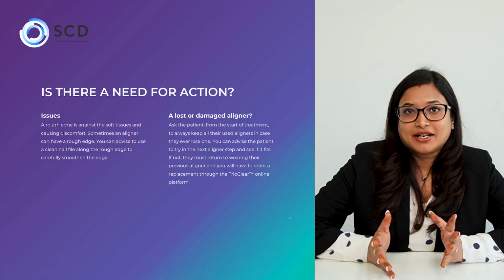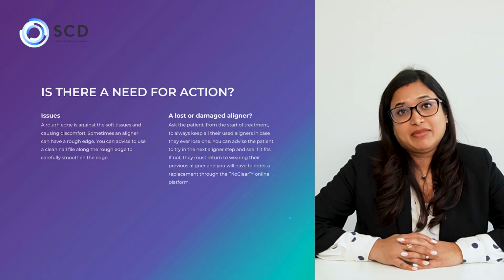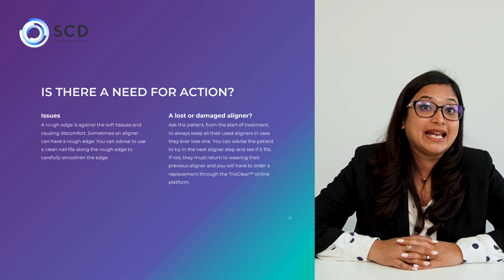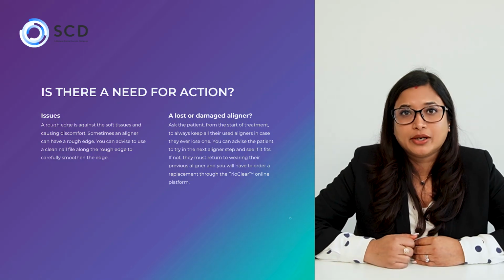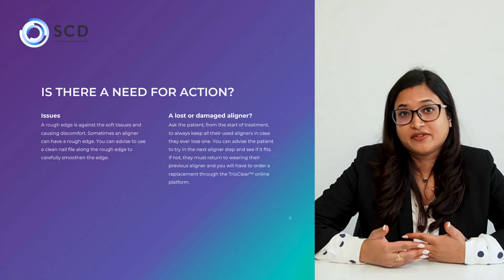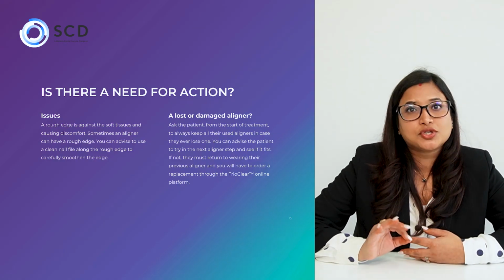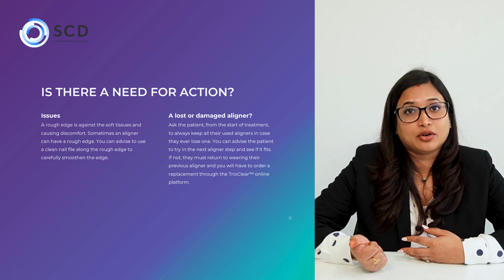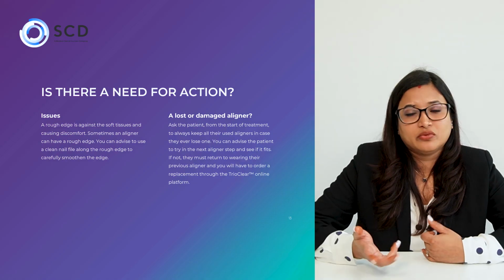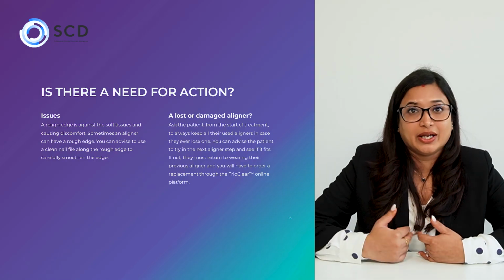So basically, what actions do we need to take or make sure that we follow during the appointment is, first of all, if the patient has any kind of complaint. When the patient enters your appointment, you make sure that you have a checklist prepared to ask the patients if they're facing any issues. Usually the most common one is whether they're fitting well or not, which we have already dealt with. They're having some issues with the wearing and removal. We have dealt with that, and compliance also we have done.